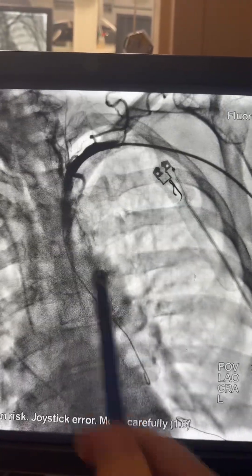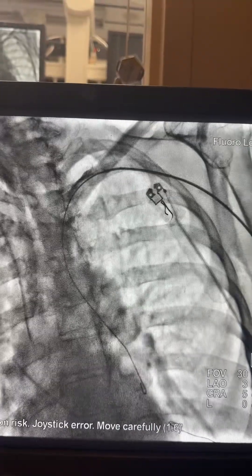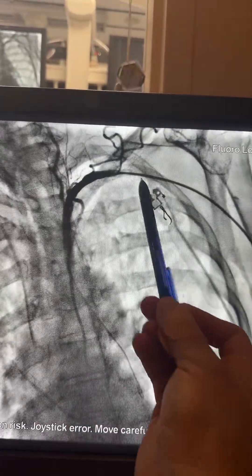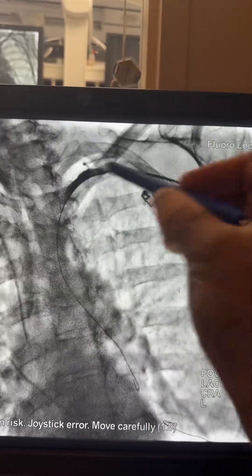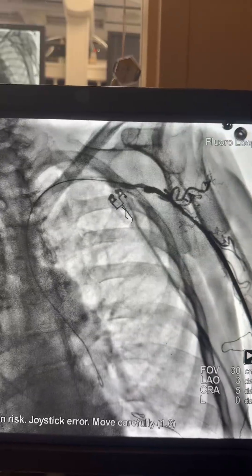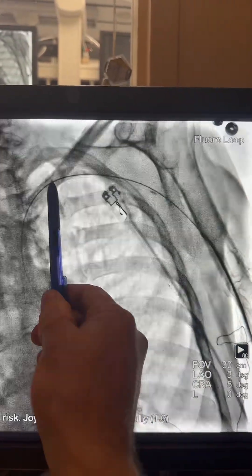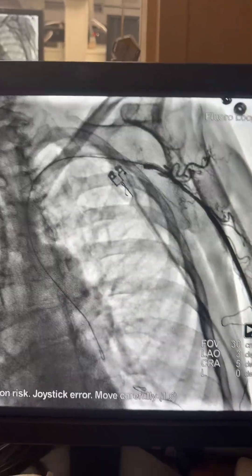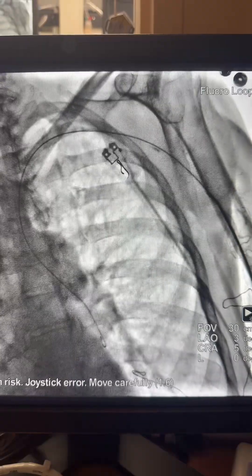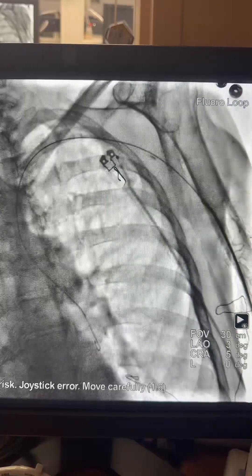I pulled the catheter over the wire and did an angiogram of the left subclavian. The subclavian looks okay here but is diseased further along, so I pulled the catheter and checked the gradient. There are significant gradients — 60 to 70 millimeters of mercury — between this segment and the left subclavian, which explains why the patient is on pressors and why we could not feel the pulse in the left arm.